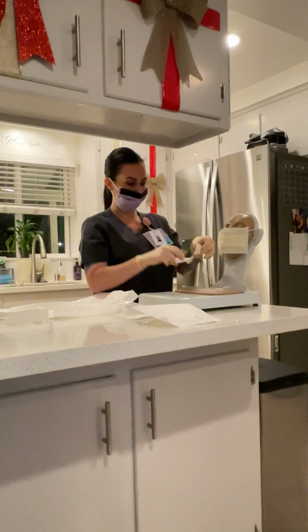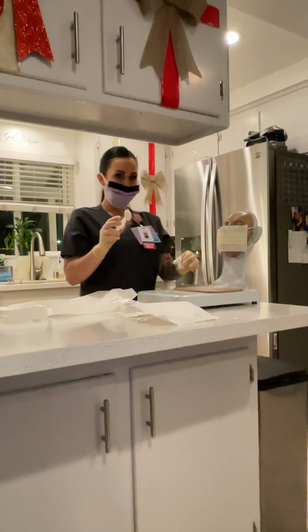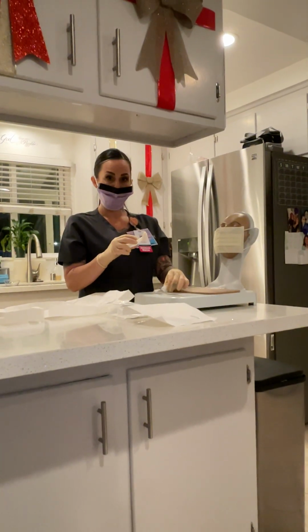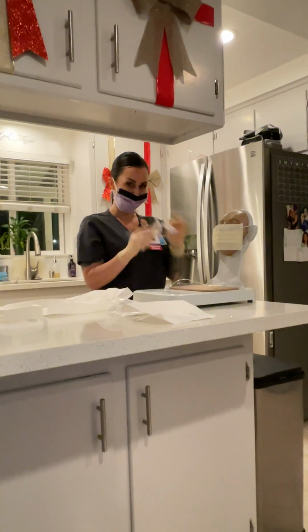I'm also going to clean the catheter itself. All right. And it is from top to bottom, and then we're going to lay that back down and allow it to dry completely. You don't want to do any fanning or any blowing. Okay, so we're going to throw everything away here.